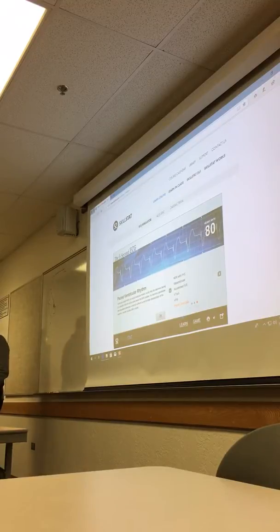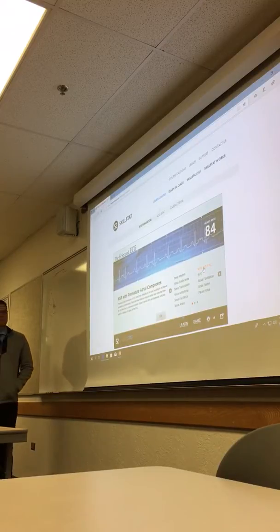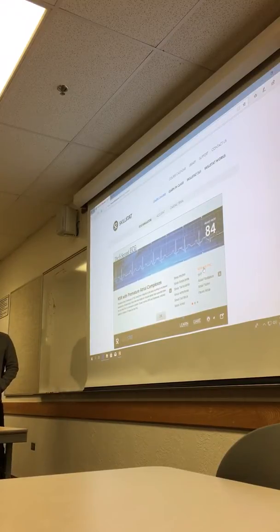Becca, you have a question? Do the atrium in this just not contract ever? Yeah, we're okay not using it. They'd probably be on Coumadin just to make sure that nothing got caught up in the atrium as well, but the only thing that's working is the ventricle. So our atrium is mostly emptying by gravity. Okay, so those are your atrials. You've got your premature atrial contraction, your SVT, your atrial fib, your atrial flutter, and your paced atrial.